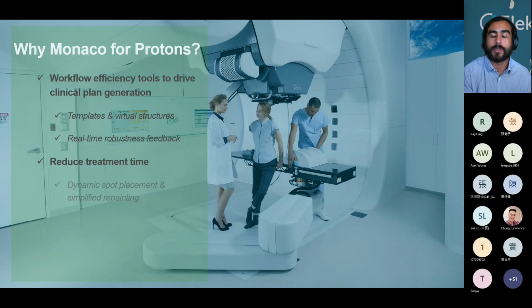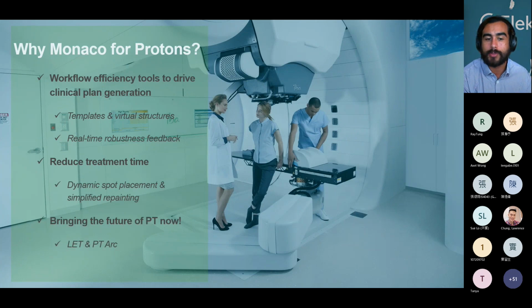So why Monaco for protons? Hopefully I've reminded you of some of the reasons, but we have this workflow efficiency to drive clinical plan generation. We reduce treatment time through our software solutions. And with our new horizon functionality, we're bringing the future of particle therapy now.